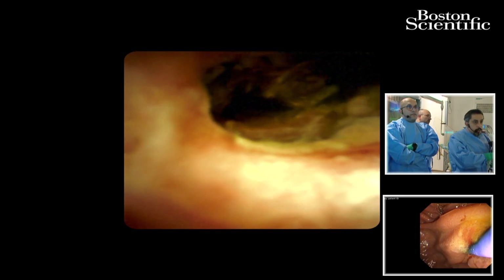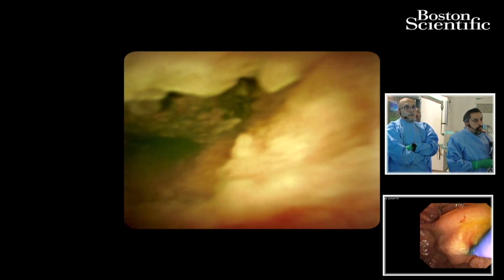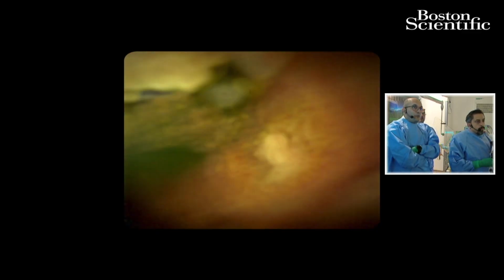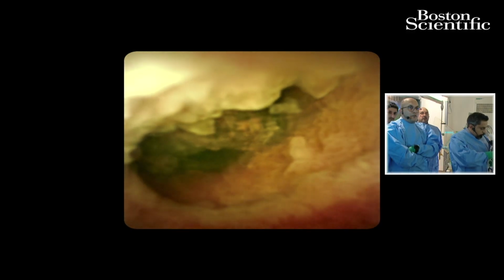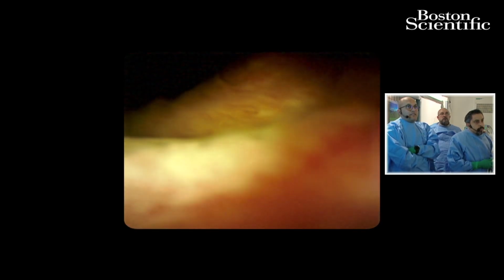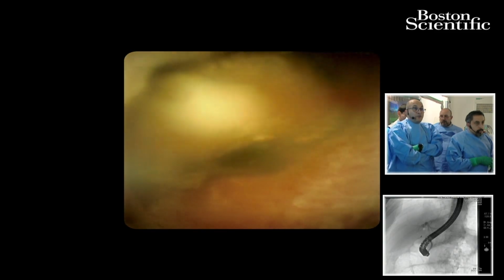What did you think of that with the spyglass? Yes, you are right. During introduction of the cholangioscope, we see that it is not ideal. We perform 8 millimeter balloon dilatation first, and we see that there is no definite stricture, but we can term it like tapered distal CBD. It is incompatible: different diameter between the proximal CBD above the stone and the distal one below it, but no definite stricture.